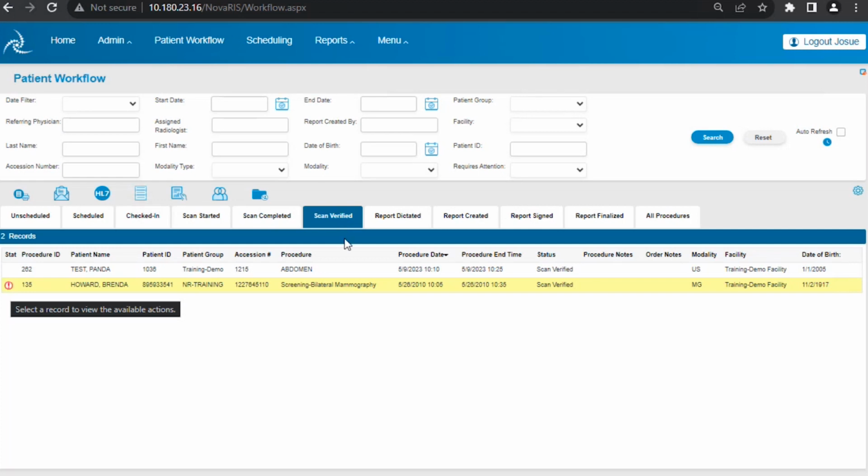Before that, even if the technologists have taken all the images, sometimes they may have other paperwork. They may have to look for the patient history and compile all those documents if they are still using paper, maybe moving all those patient histories from the archive to the doctor's desk so the doctor will have them there. Again, it will vary by customer, but if you want, you can now track that. That will also let you know within the RIS that everything is ready to start reading the reports for those procedures. And that is, again, the patient workflow.